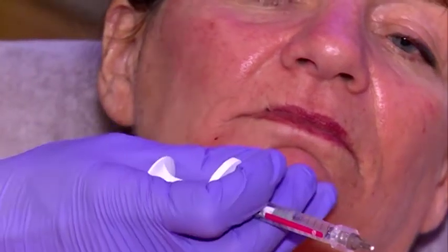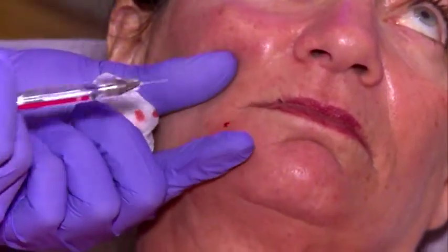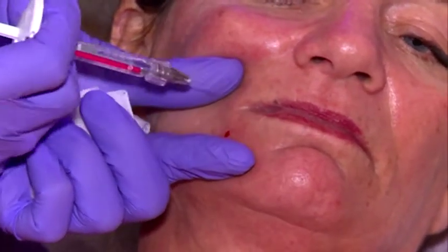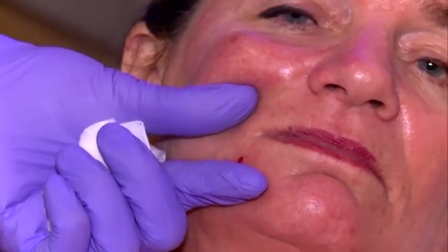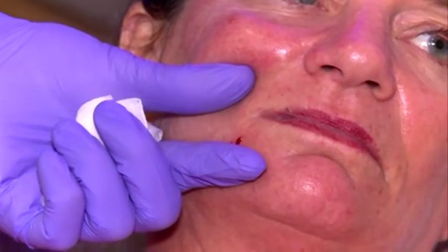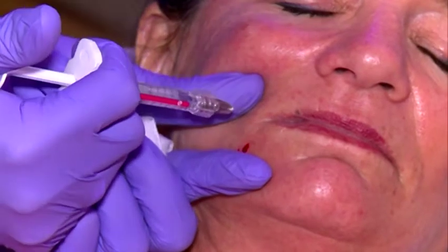Yeah? Is it okay for you? Yeah. Okay, so what I'm doing here, is it on the screen visible? Yeah. Good. So I open the corner of the mouth and go into the lip and make like a horseshoe. 3 injection points with minimal aliquots of product.